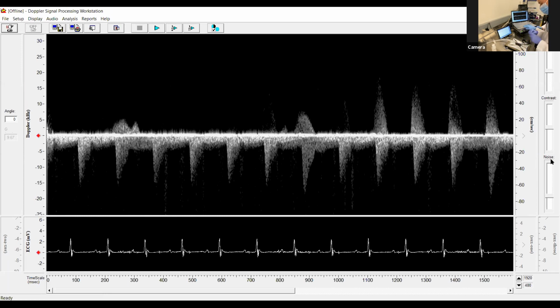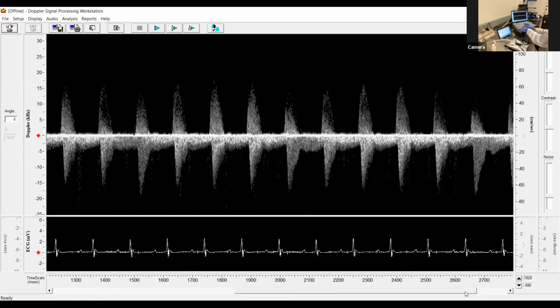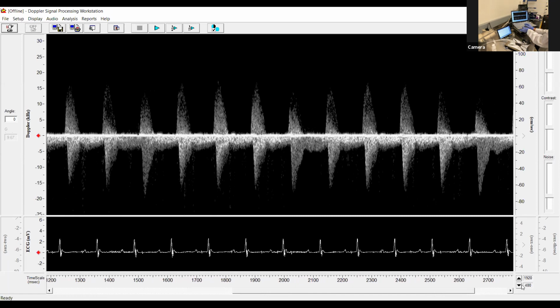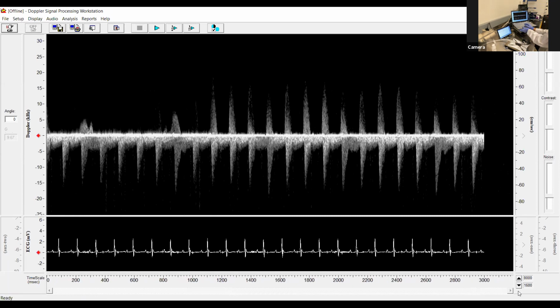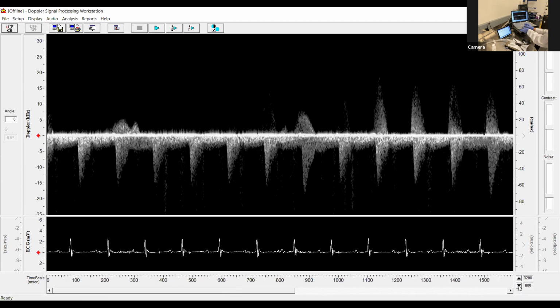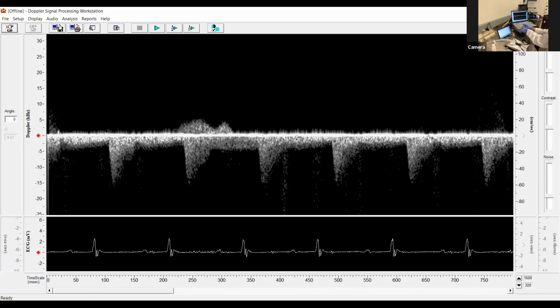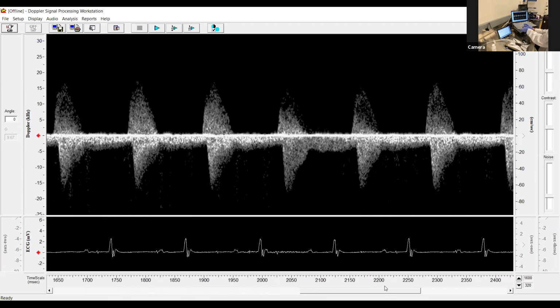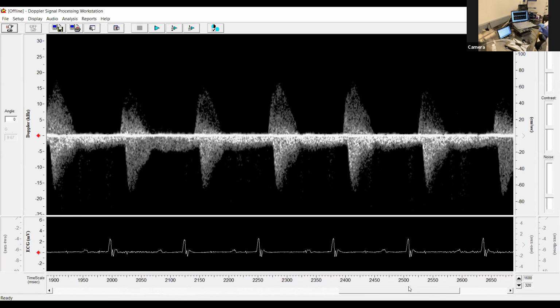If you want to expand, you can run it better. So let's go to a strong signal that's closer to the end. Yep, and then expand your time interval, for example, on this one. Okay, so down here, we can actually change the timing interval. And so as we do that, you can start to see the difference in velocity.